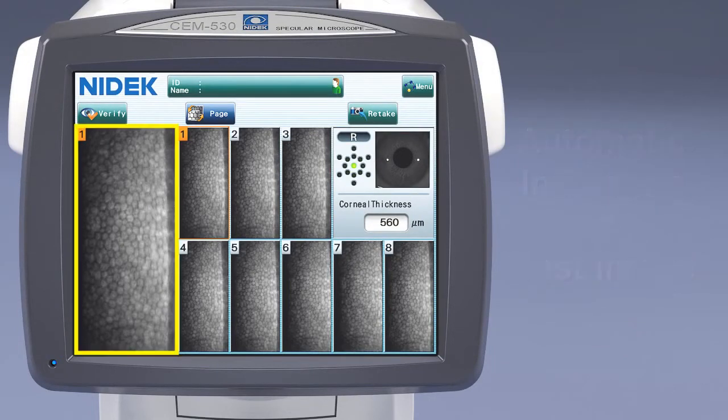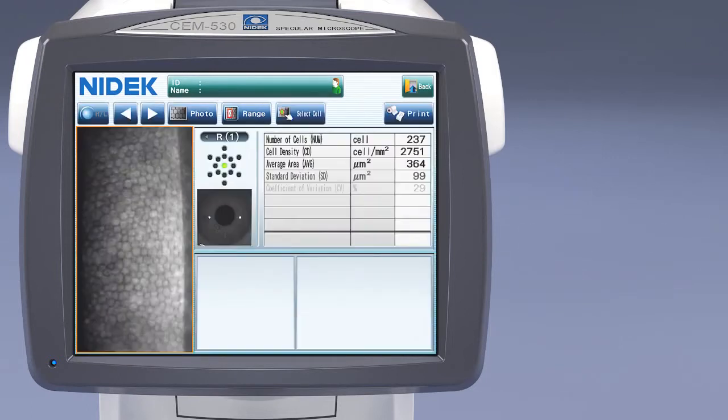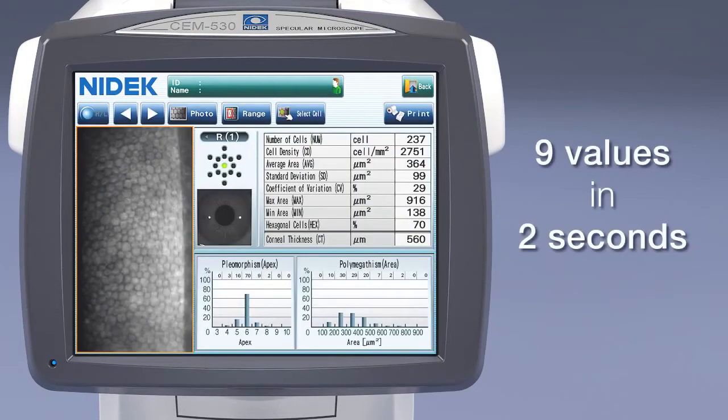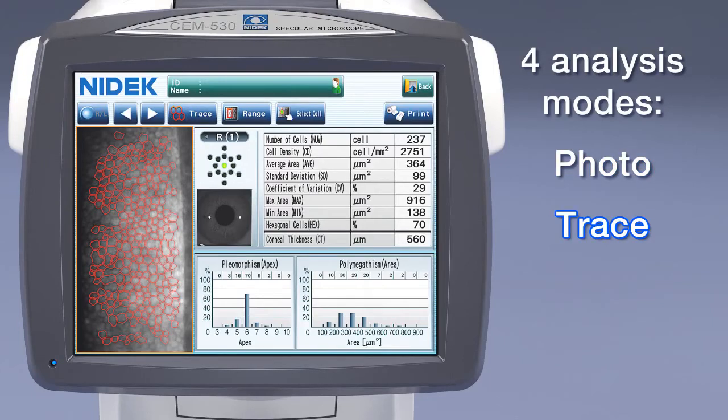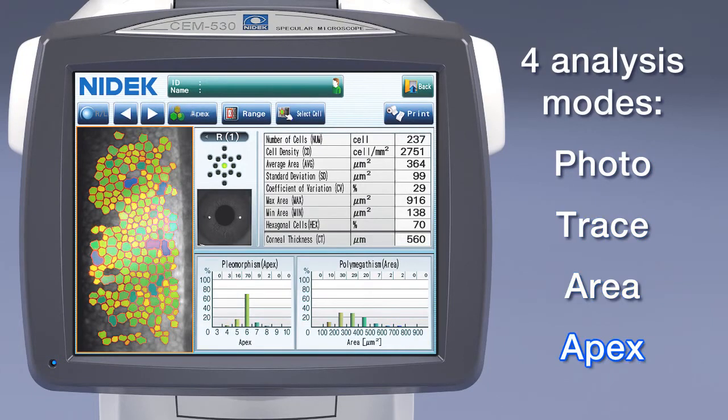Once an image is selected, the CEM530 automatically performs a complete analysis in just 2 seconds that provides 9 essential values. The analysis screen allows for visualization of the endothelial cells in 4 modes, including photo, trace, area, and apex, for cell observation and evaluation, and to determine if cells are normal or stressed.